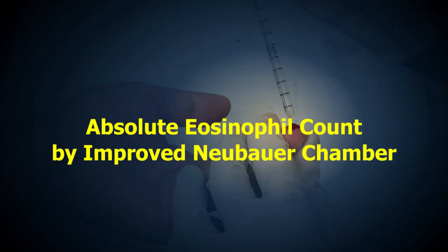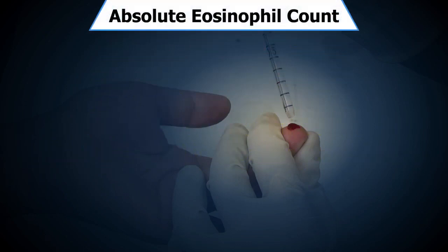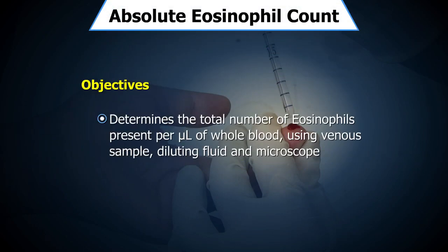Absolute eosinophil count by improved Neubauer chamber. The objective of this test is to determine the total number of eosinophils present per microlitre of whole blood using a venous sample, diluting fluid, and microscope, and to understand the precautions to be taken during the procedure.